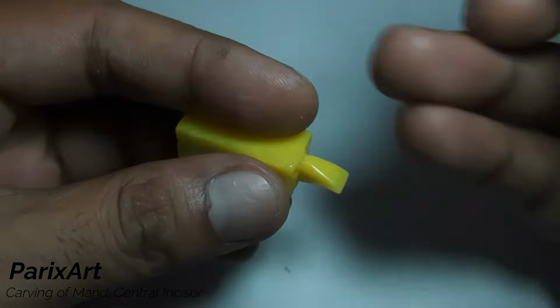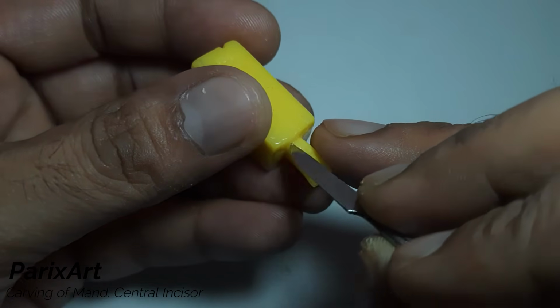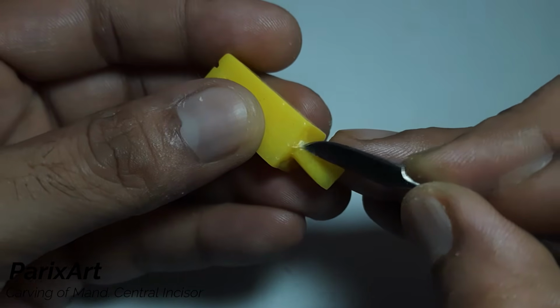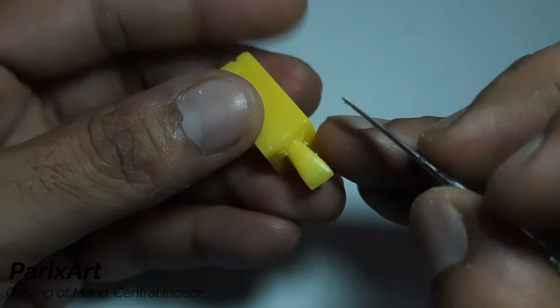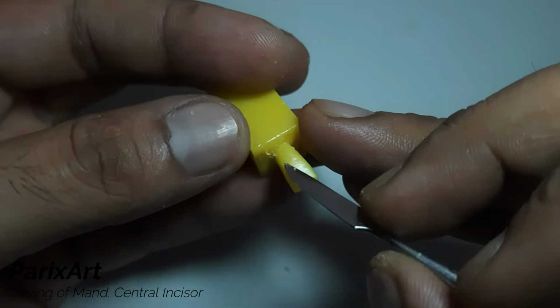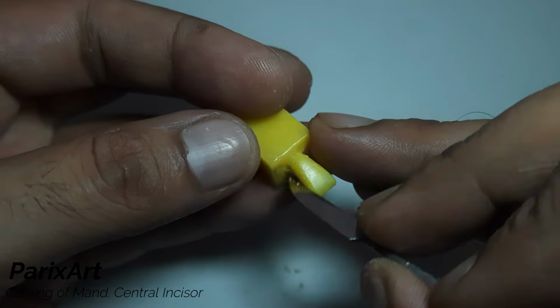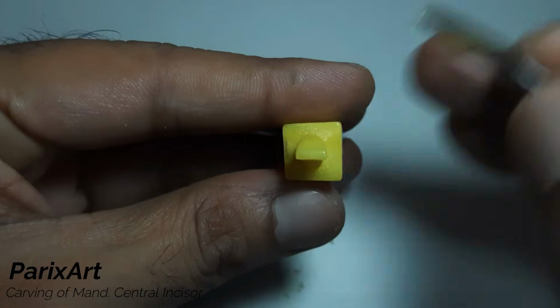Just need little rounding off at the cervical. Okay, now this is fine.